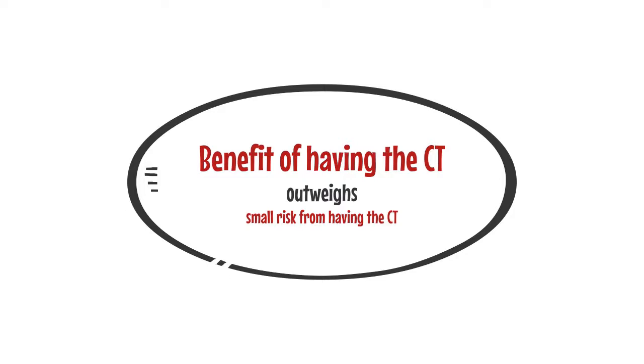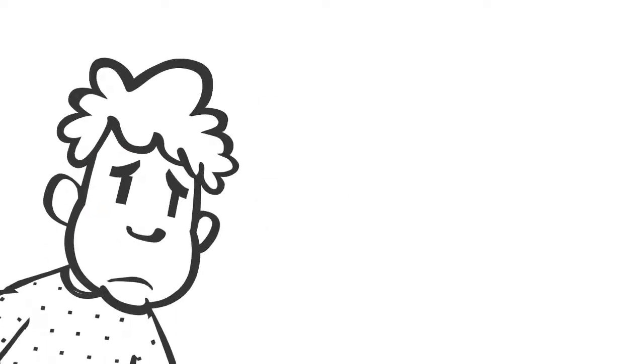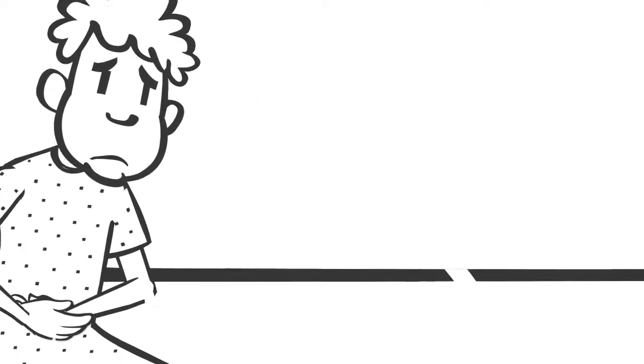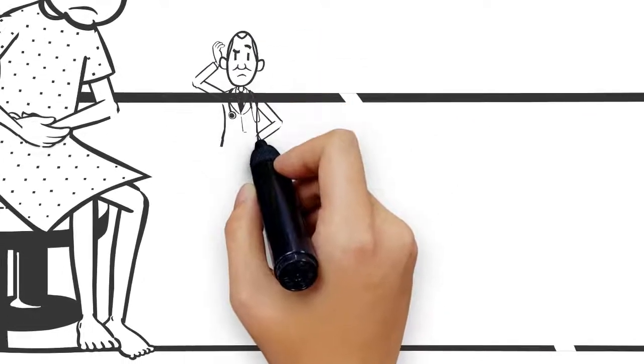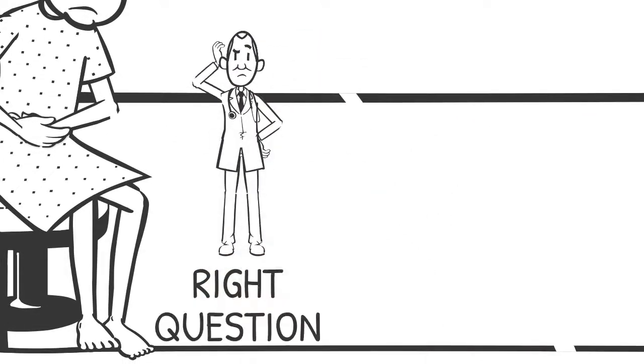Often, the alternative to imaging is to have exploratory surgery. Because of imaging, this is now uncommon but is associated with higher risks. At all stages in your care, everyone works together to reduce the amount of radiation you get to the smallest possible amount. As the referrer, I ensure that I have a clinical question that I need the answer to in order to provide the best possible care for you.